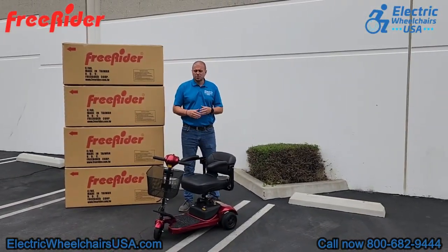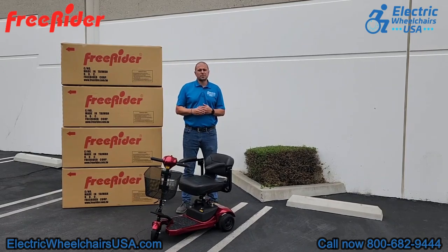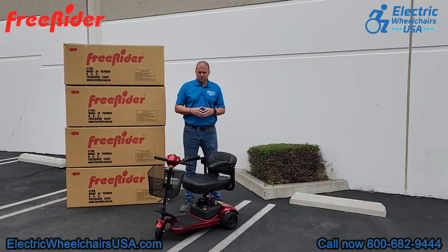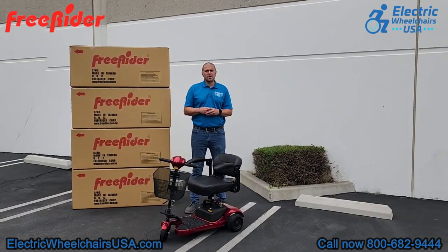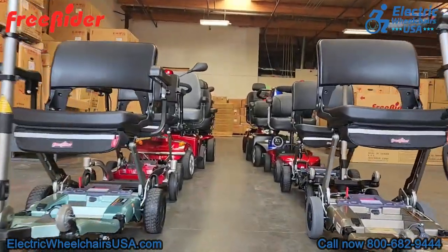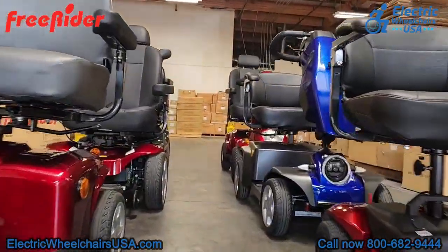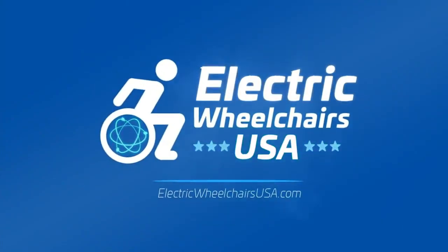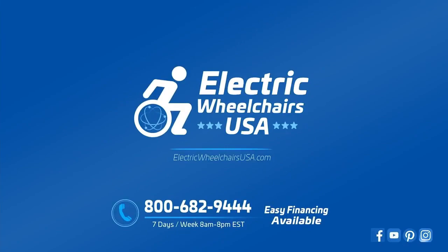In conclusion, if you're looking for a portable mobility scooter that's not going to break the bank — economical and reliable — the Ascot 3 is a great selection. We love working with Freerider; they've been in business for over 30 years and we have a great relationship with them. If you have any questions about the Ascot 3 or any of their products, feel free to give us a call at 1-800-682-9444 or visit us at electricwheelchairsusa.com.